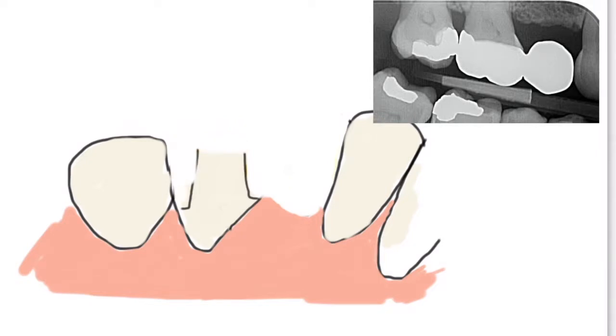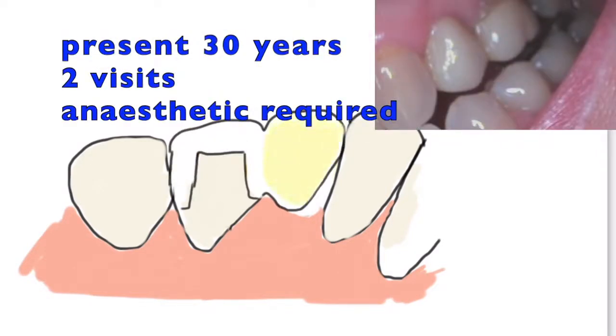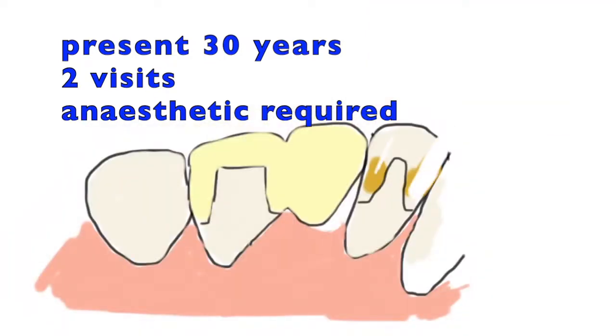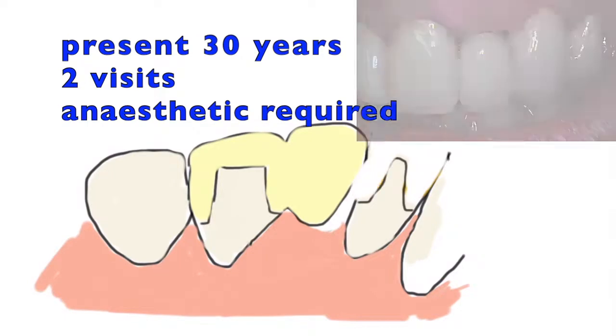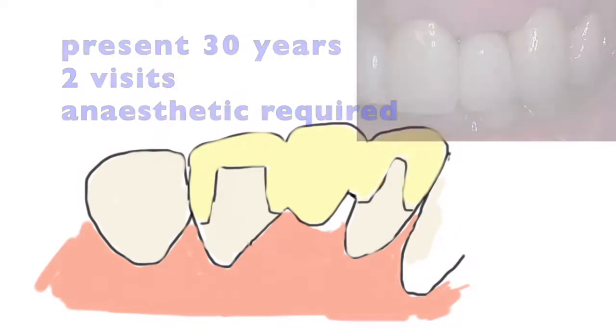What we can do is make a crown off a single tooth, and then that supports the single false tooth, and these have been very successful as well, especially if the supporting tooth has already had some restoration or has since discoloured. And going on again, we can actually use the teeth either side, and this is obviously a lot more rigid.